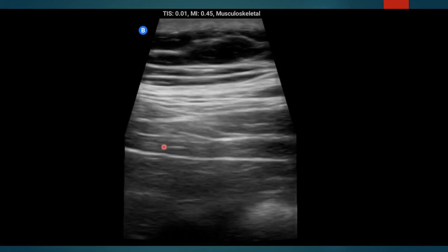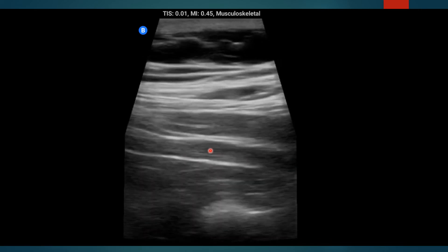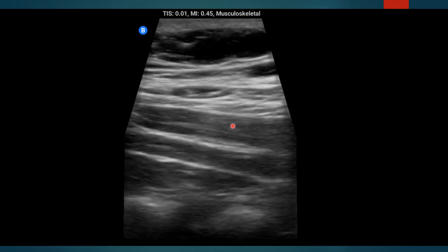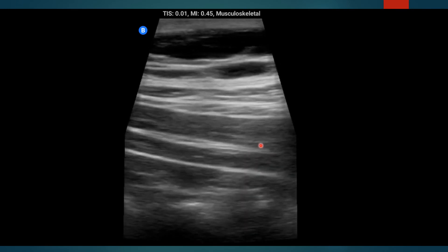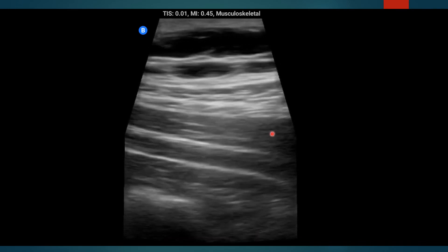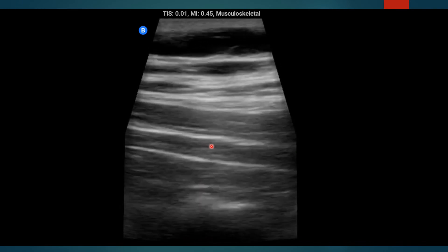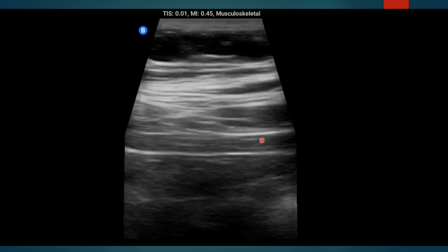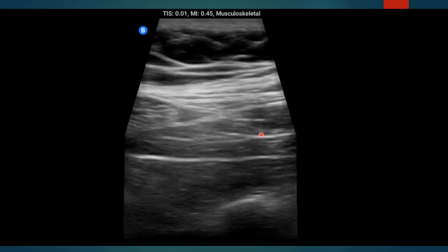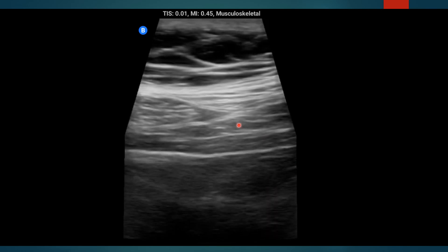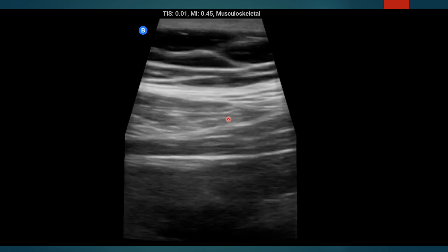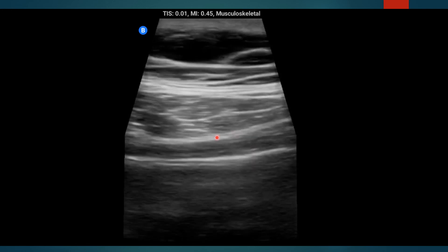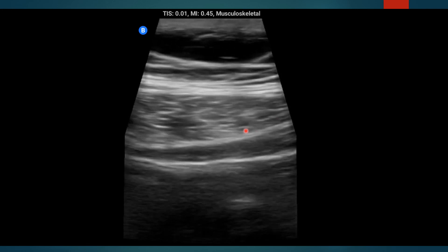The transverse continues on where it eventually meets the internal oblique in your more traditional TAP midaxillary view, with the fascial plane there. I'm now scanning medially again, and you're going to see that aponeurosis coming into view — and that is where you want to inject for your subcostal TAP.